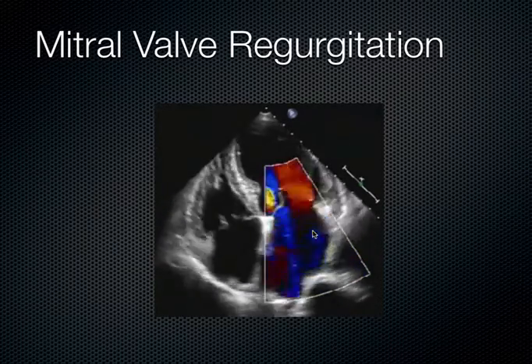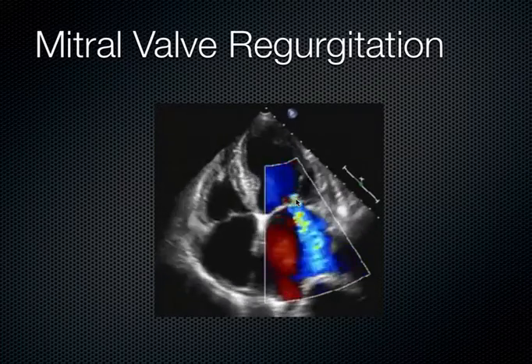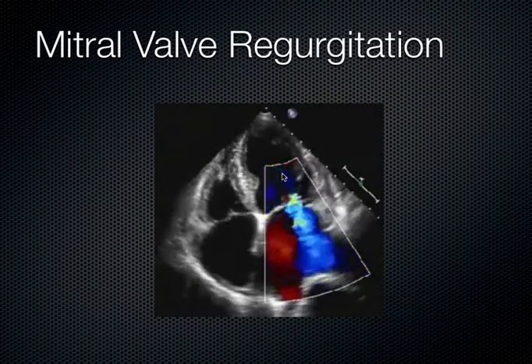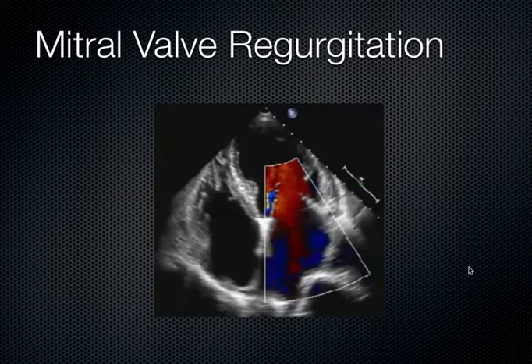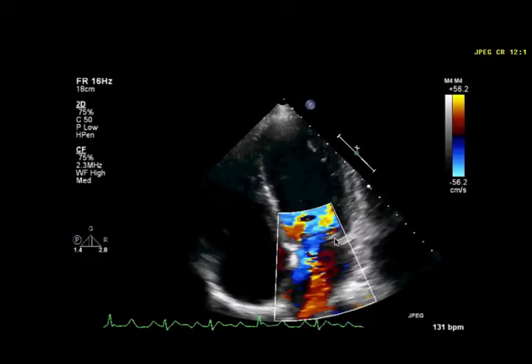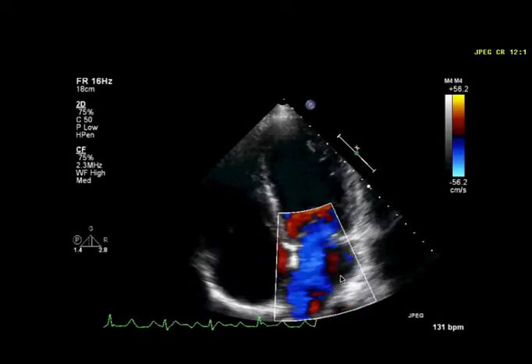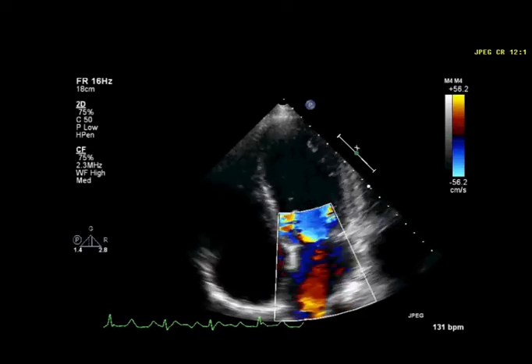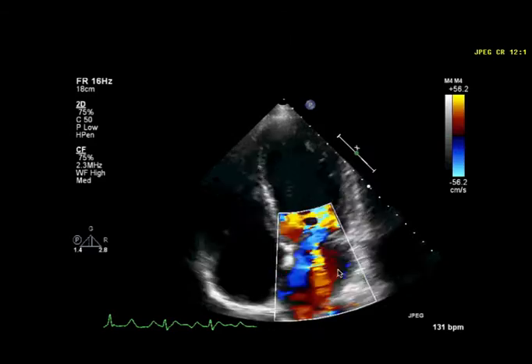See, during diastole, we see the red come right up into that ventricle, which is what we expect. But then during systole, we see all this blue away right through that valve. And that's severe mitral regurgitation when you see that. Put another way, we see another blue jet on this other heart squirting to the back wall, and that's not good. That's not supposed to happen. That valve is incompetent, and we have a lot of blue away happening right there.